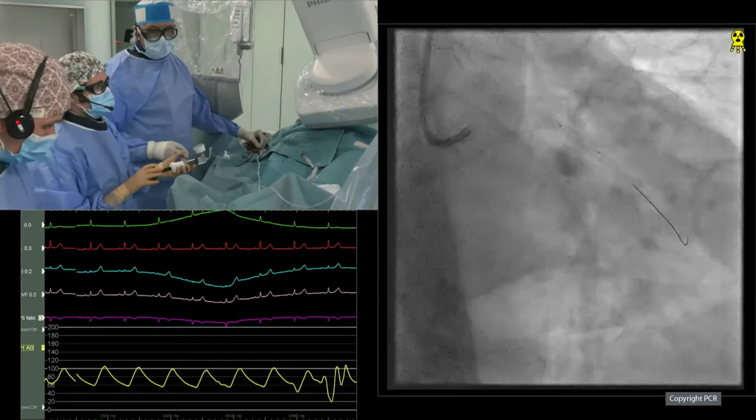And just to come back to the point of Florin before, when would you do backward and forward orbital atherectomy? The advantage, I think, of going retrograde with the crown is that you avoid that jumping of the crown forward, where you're sometimes pushing against harder material if there's a more severe lesion where there's a resistance to crossing. So I think in that way, if you can glide assist across, it's actually easier to go backward first. I possibly would still go forward having gone backward because I might want to do 5 or 6 runs, and I don't think there's a huge disadvantage in that respect.